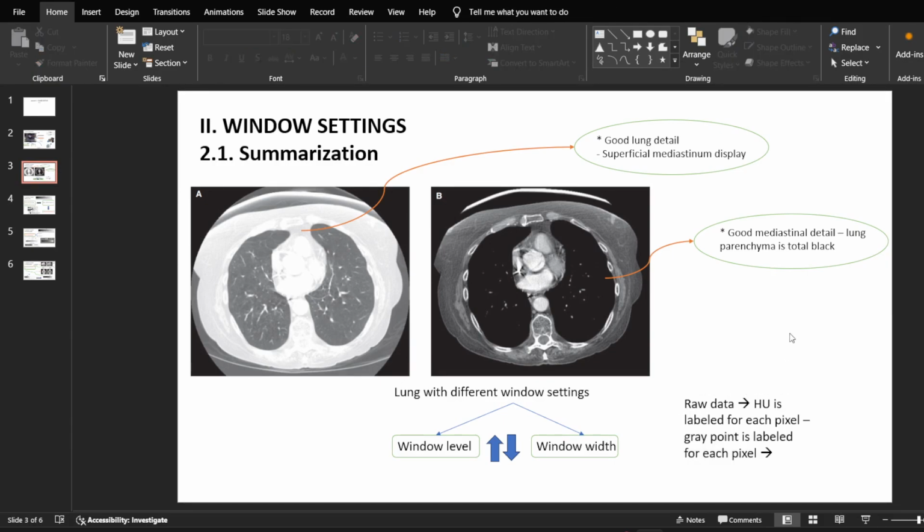So what is it used for? It's used because we can change the way it's displayed, so we can adapt it. Every single image display method needs to be changed in specific circumstances.